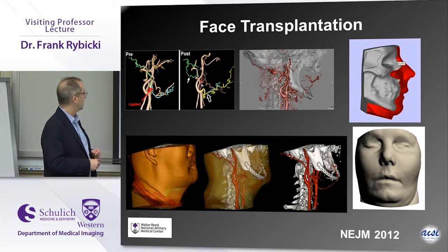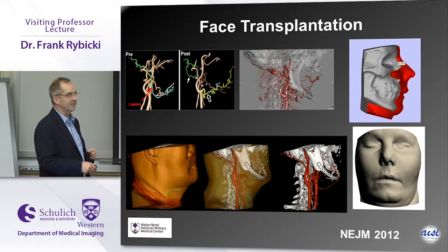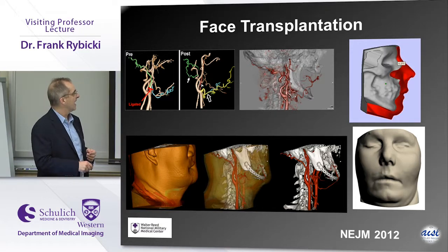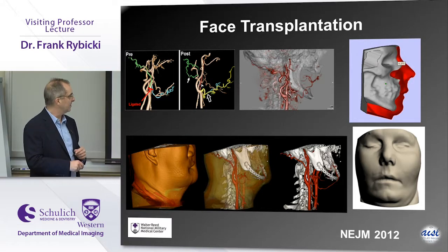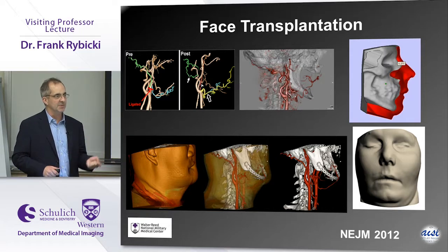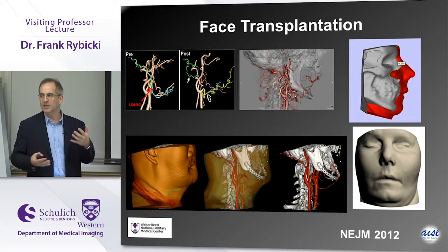So in Boston, I worked very hard. This is the logo of my old lab with Walter Reed, and these are the people I started doing 3D printing with, actually doing a lot of visualization. We actually did face transplantation, and that was one of the things we were known for in our organization. We were able to do reconstructive surgeries and make 3D printed models, customized devices, and patient-specific implants. And there's a large component of 3D printing that lives in craniomaxillofacial reconstructive surgery.